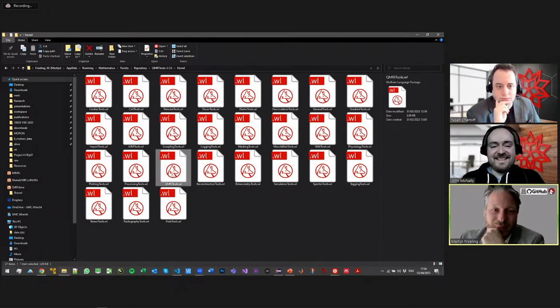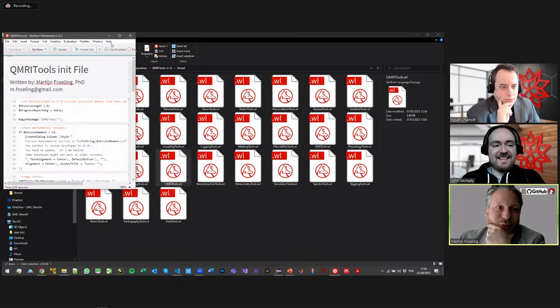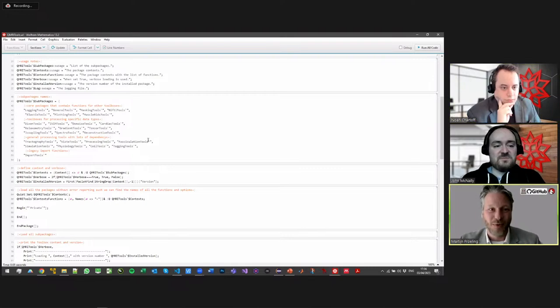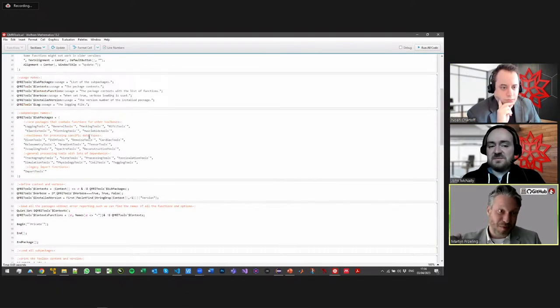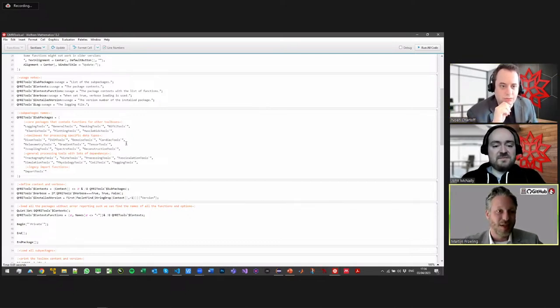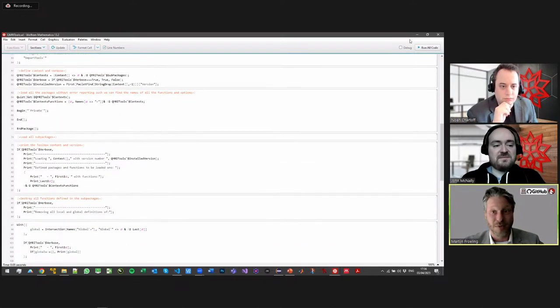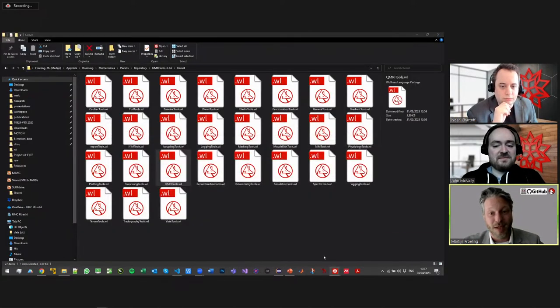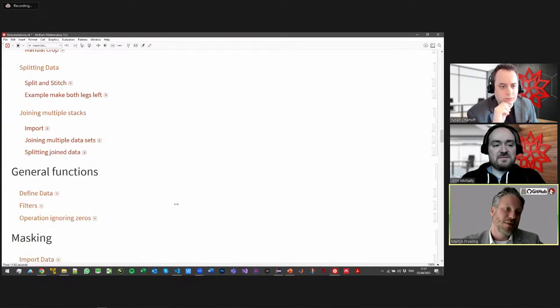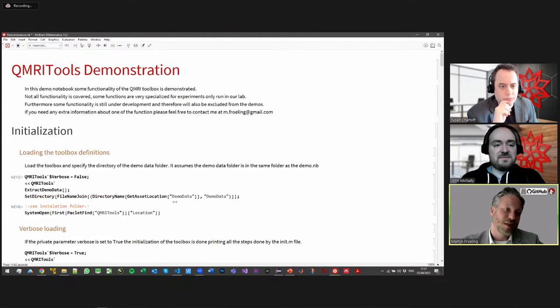So this is, of course, the main loader that actually loads everything. But it's not just calling Get on the toolbox, it's also removing all context from all the function names that are in the toolbox. So it destroys all previously made definitions that might interfere with my toolbox. Oh, that makes sense. Yeah. It reruns everything. It loads the documentation. It also has some feedback when you load it. When I'm debugging or things are going wrong, I can actually do something like this.